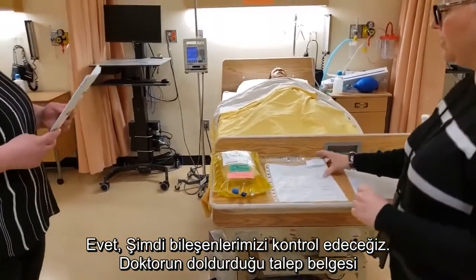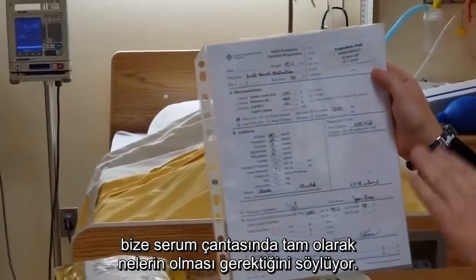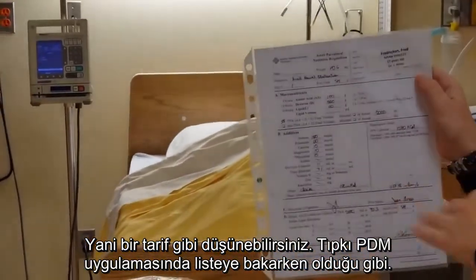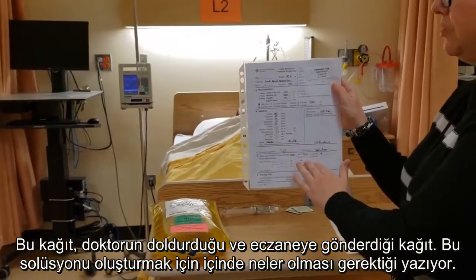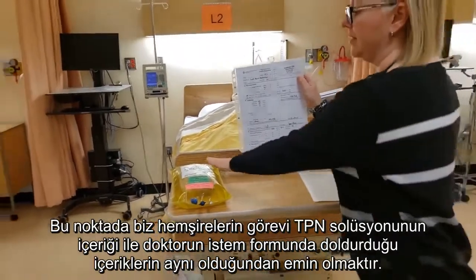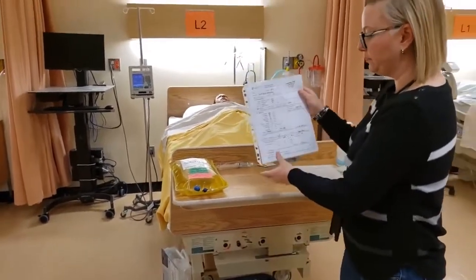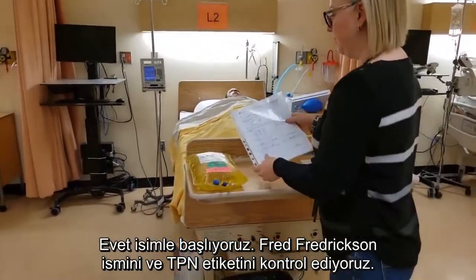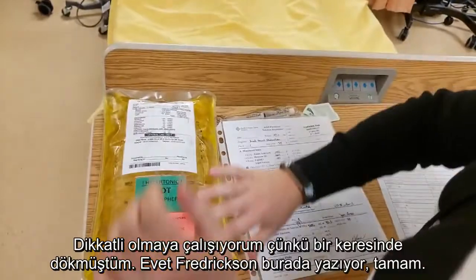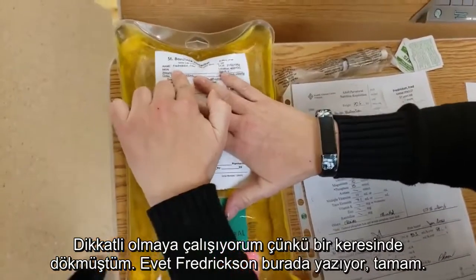Now we're going to check our components. This is the requisition that the physician would fill out — it tells us exactly what needs to be in this bag, like a recipe. This is what the doctor fills out and sends to pharmacy in order to make this. It's our job as nurses to ensure that the tag on the TPN matches all the components on the requisition perfectly. So it starts with the name — Fred Fredrickson — and on your TPN label, Fred Fredrickson is right up here.